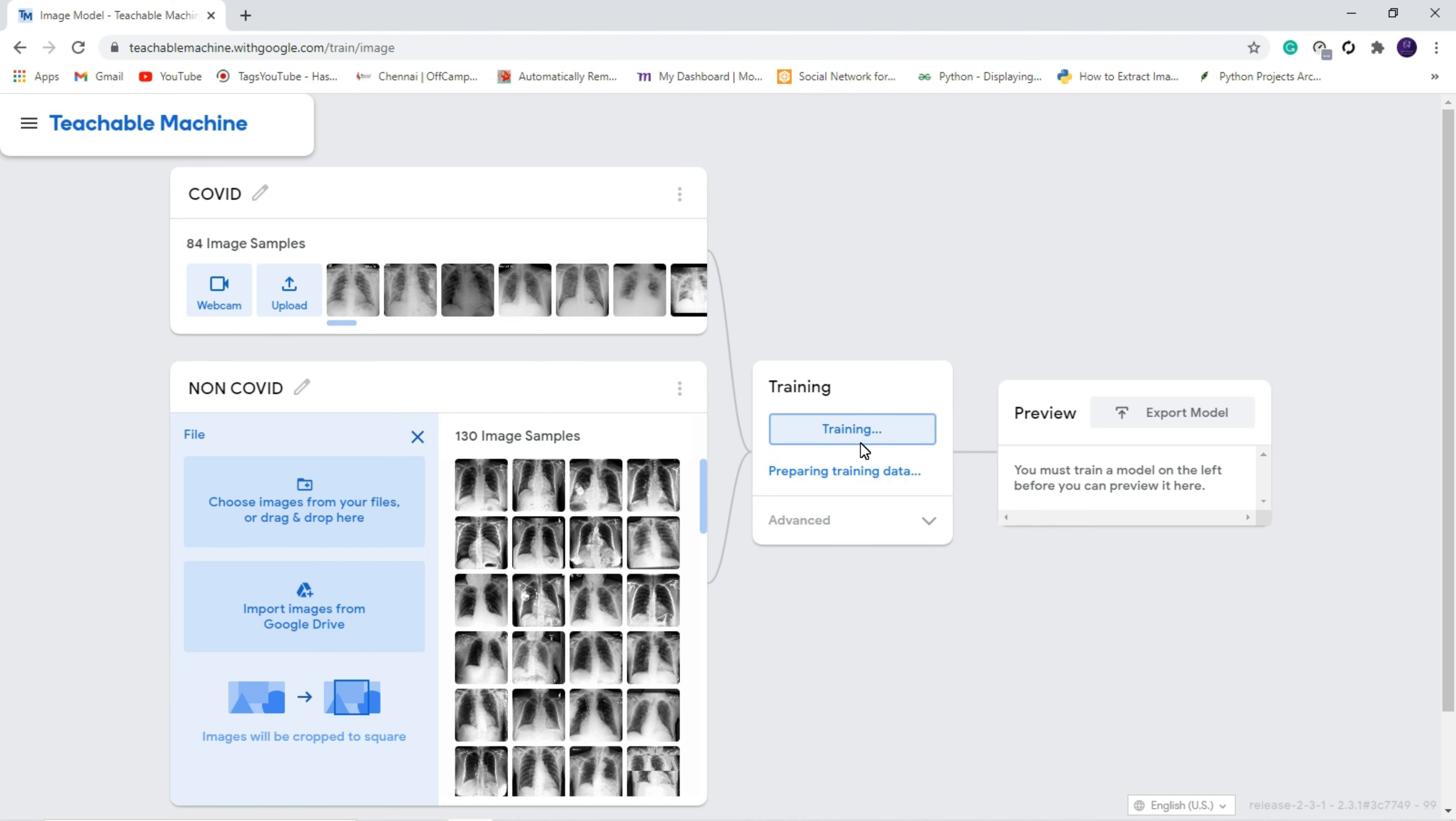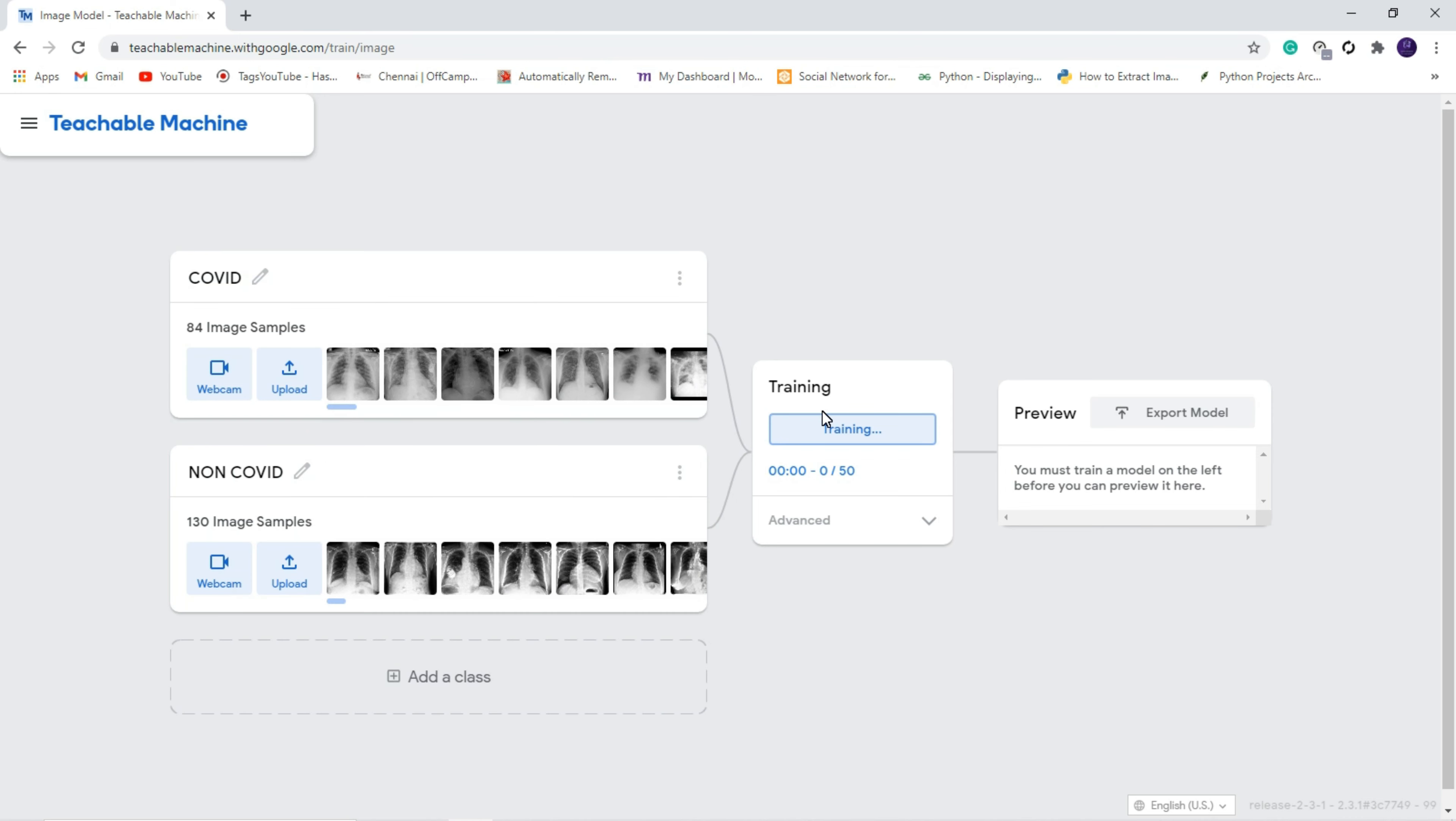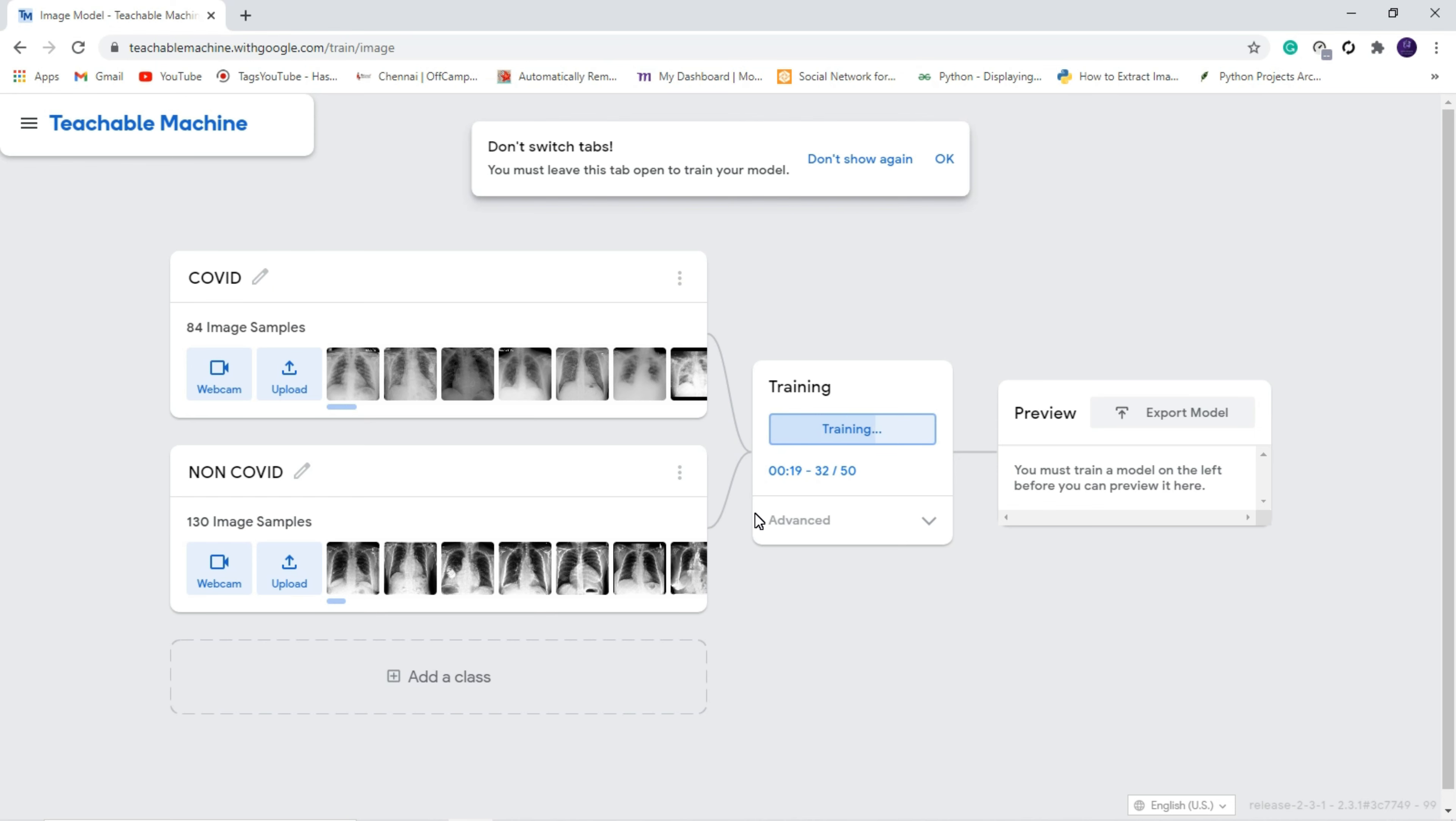By clicking that training, it will automatically create our machine learning model with the help of these images. Here you can see the amount of time to create a machine learning model. If you are feeding more images, it will take more time.